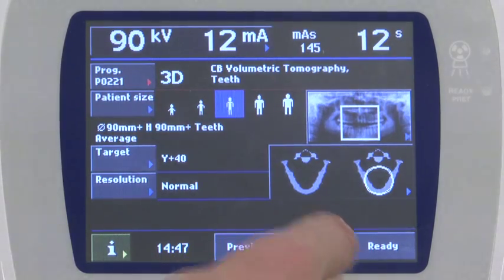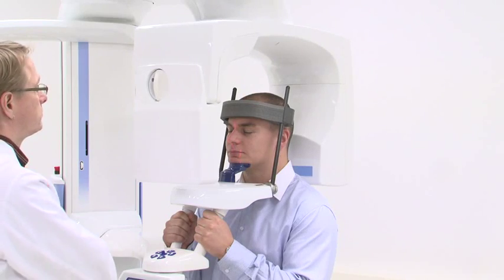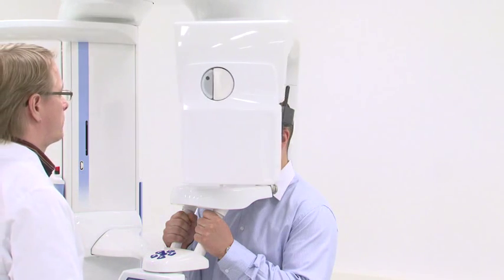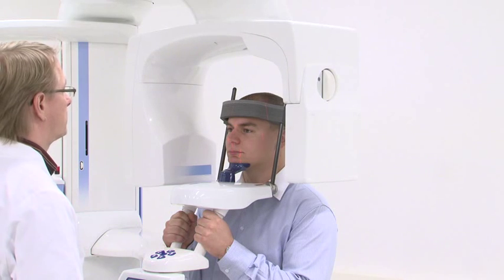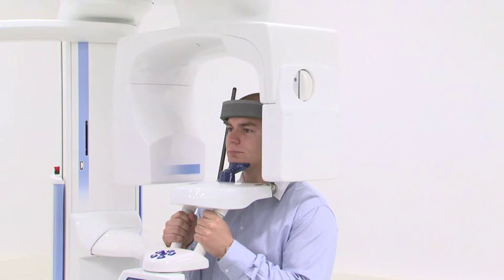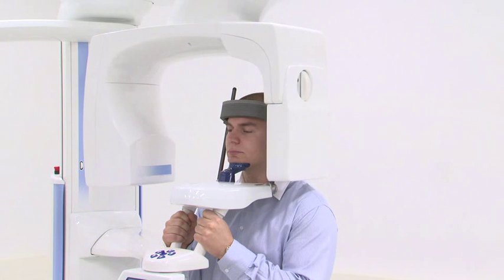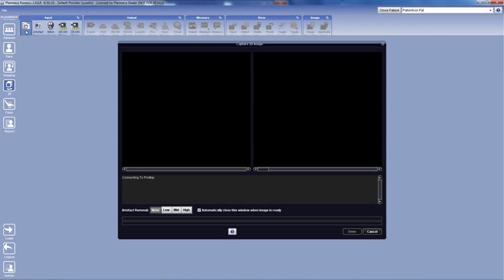Press the 90-degree button again to return the rotational arm to the entry position. Visually verify the patient is still in proper position. At the computer, click 3D capture.